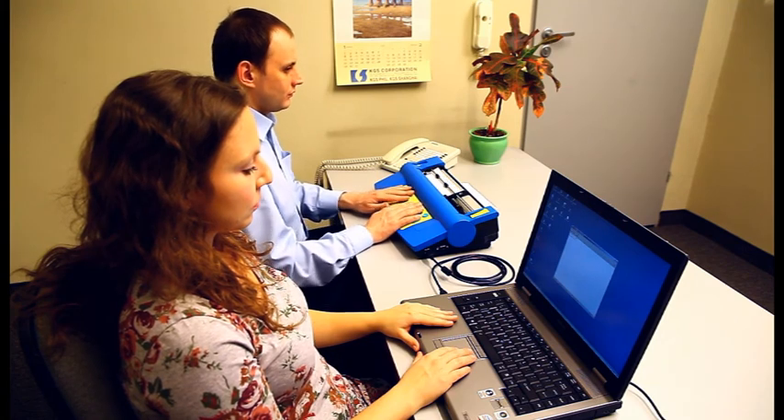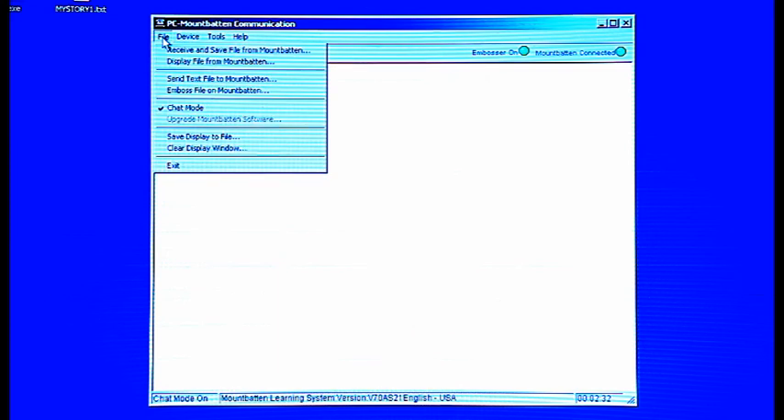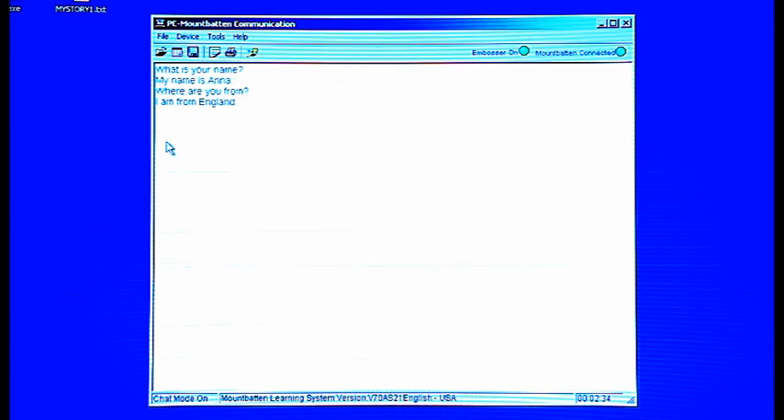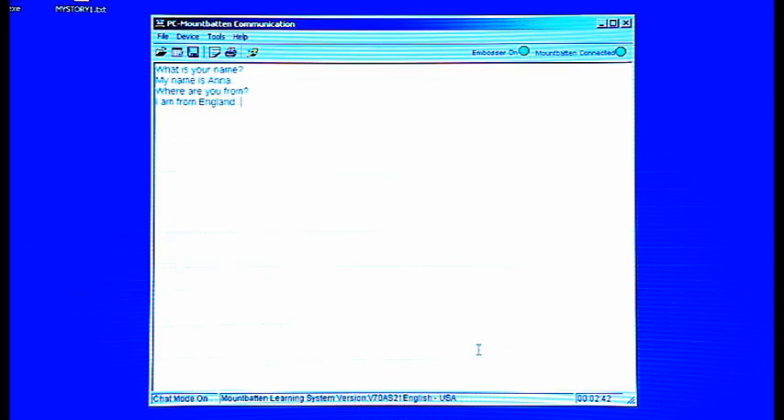The content of your chat can be saved for further use. After finishing the conversation, click File and select Save Display to File at the bottom of the menu. Provide the file name and choose the destination. Click OK and your display will be saved in a text file.